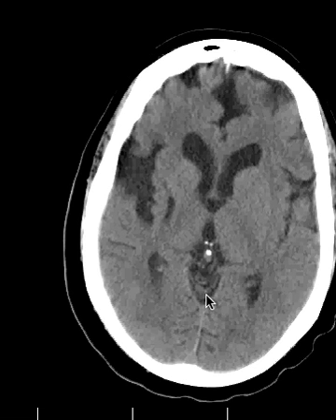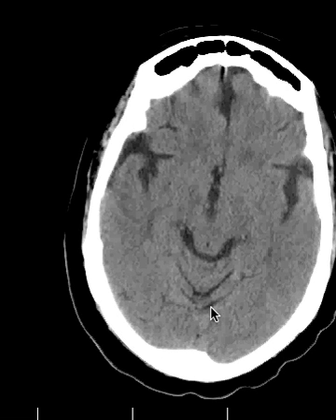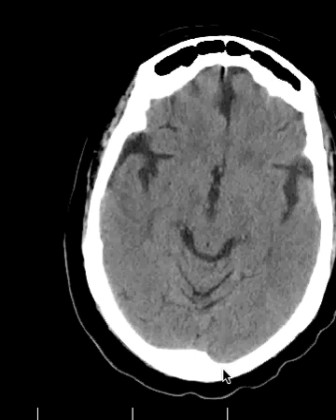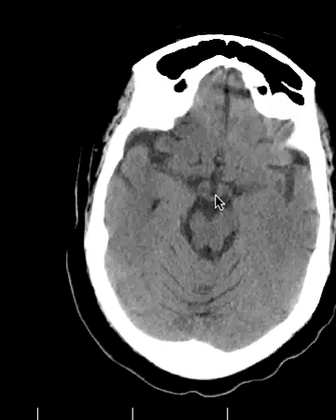Here we are at the tentorial incisura. Here's the tentorial incisura, the top of the cerebellar vermis, calcified pineal, third ventricle, lateral ventricles, foramen of Monroe coming down into the third ventricle, cerebral aqueduct in the midbrain, quadrigeminal cistern, ambient cistern on each side, fourth ventricle, prepontine cistern with the basilar artery.